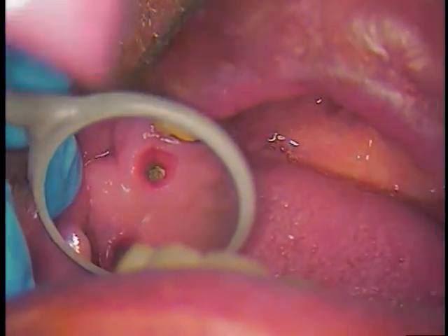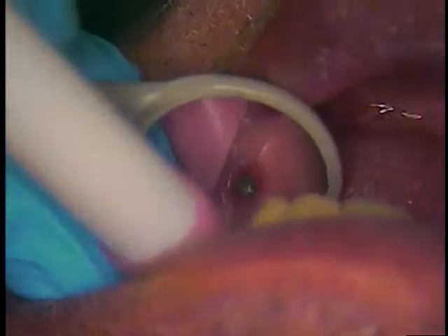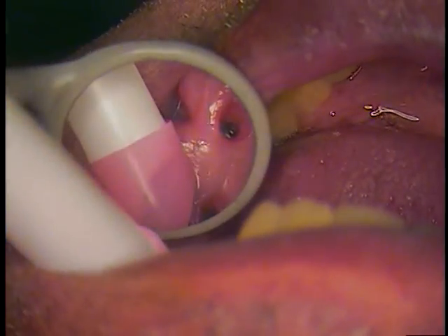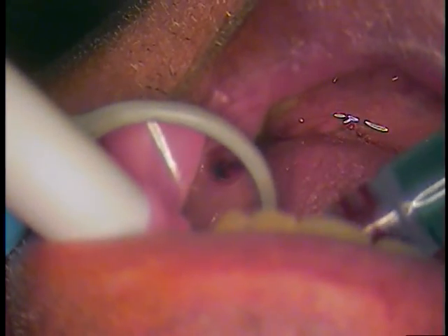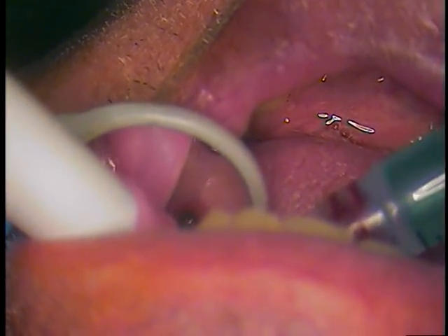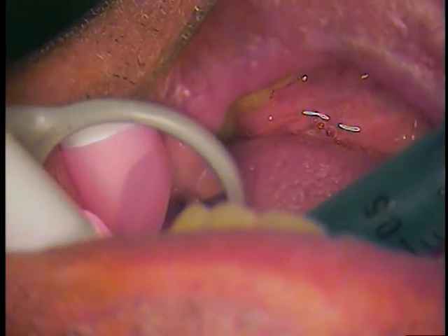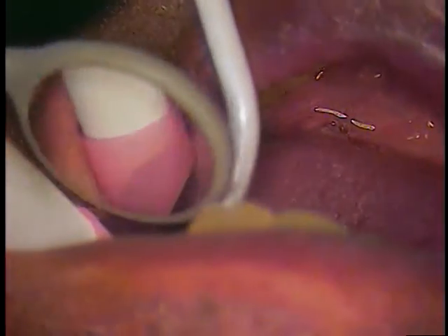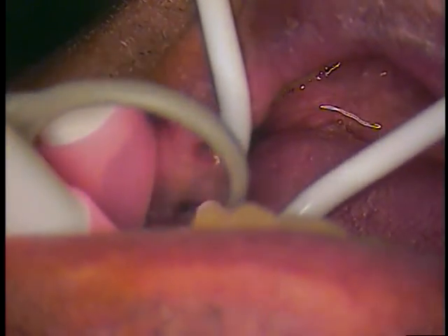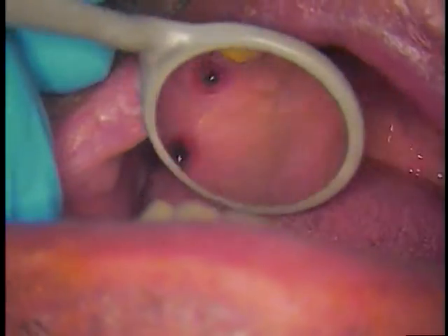First thing I'm going to do is clean out each of these areas with a little chlorhexidine gluconate cavity cleanser. And then we're going to rinse those areas and vacuum them out. So this is all routine.